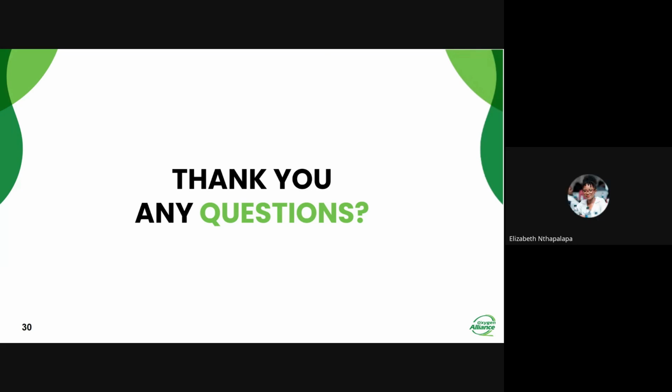Okay, let me answer the first question from Anupam. The way I've understood this question, you're asking if there is any feedback system in this machine to decide how many milliliters per breath are required, and also if there is any valve which can stop high pressure from cylinders during exhalation. My answer is yes, the modern oxygen delivery system has a feedback mechanism to regulate the amount of oxygen delivered per breath.